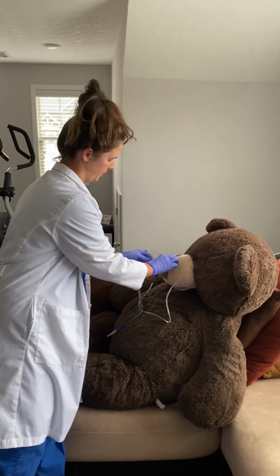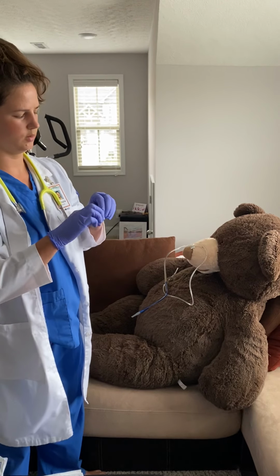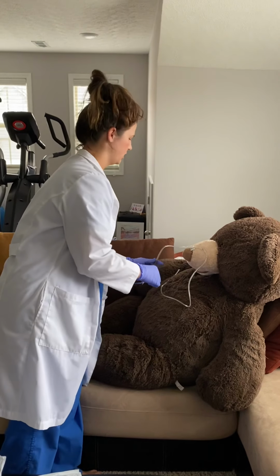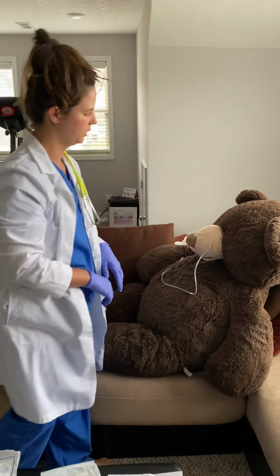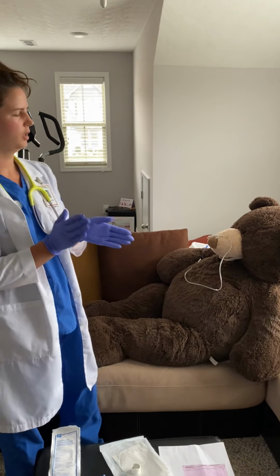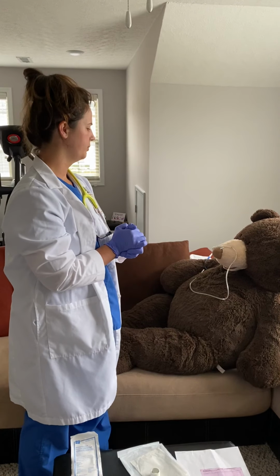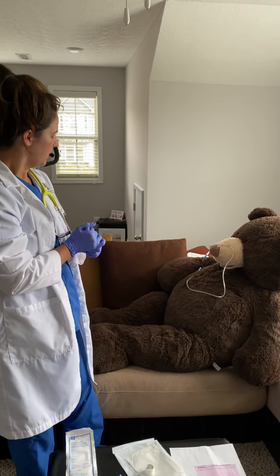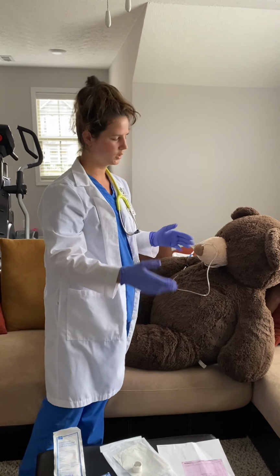Okay. Then you're going to take another piece of tape and you're going to anchor it to the shoulder, so that as the patient moves around, they're not going to be moving their placement. Okay, so he's all set there. And you just want to make sure the patient is comfortable, document how the patient tolerated the procedure. You want to document where you did the drawing of the tube and any abnormal findings. And so next we're going to talk about suctioning.